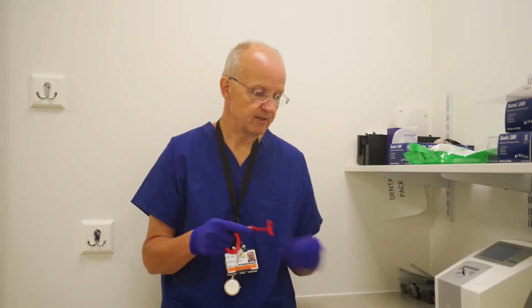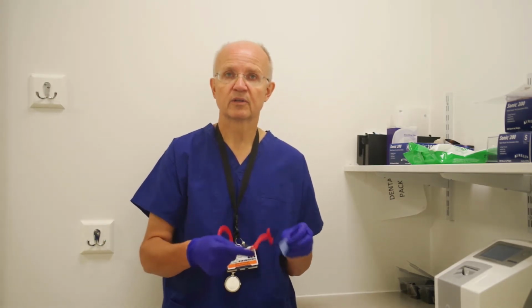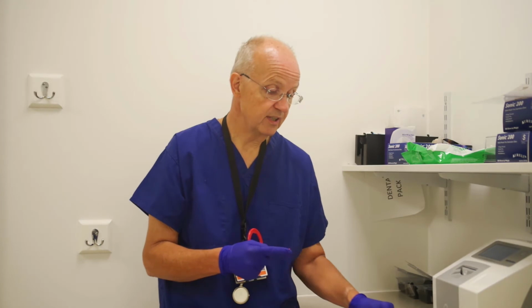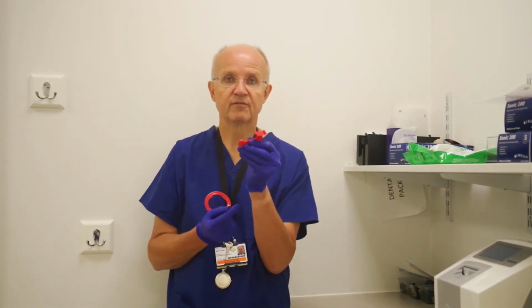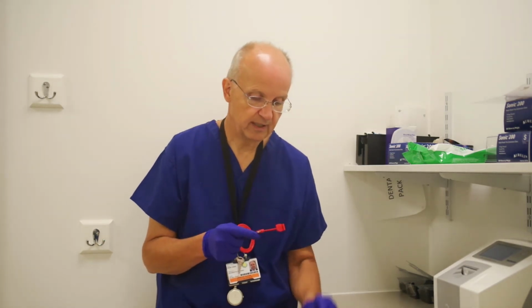And what that means is that instead of holding the film in the mouth horizontally like that, we're going to hold it in vertically. Quite often we would need to do that if there's a high degree of bone loss, because we want to see the bone level. In those circumstances, we're going to use a vertical bite wing holder, and what that does is hold the film in vertically.